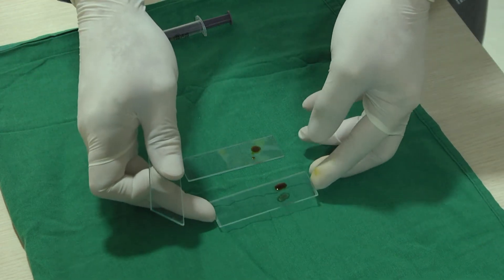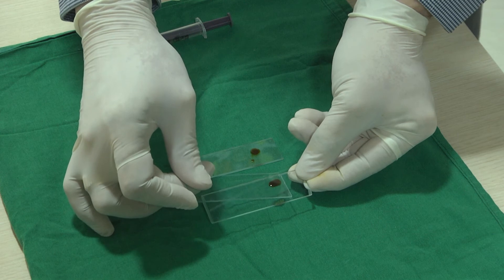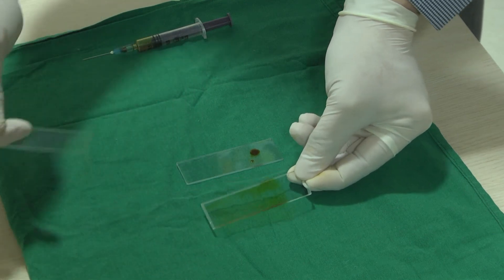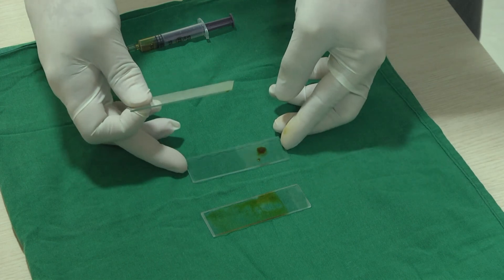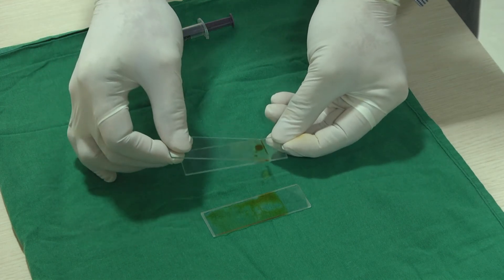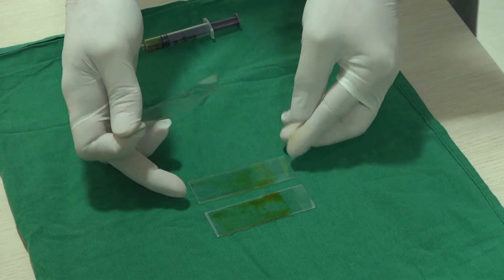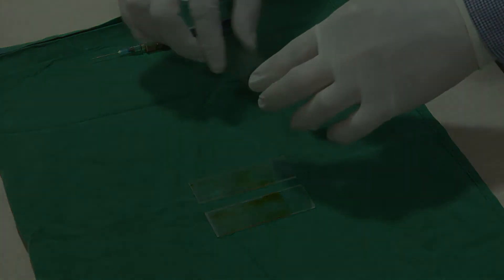A fresh slide is taken, touched to the drop, and a smear is prepared. This is air dried, labeled, and sent to the pathologist for examination.